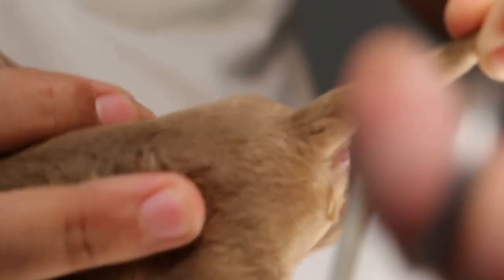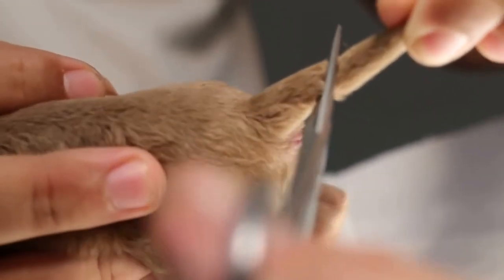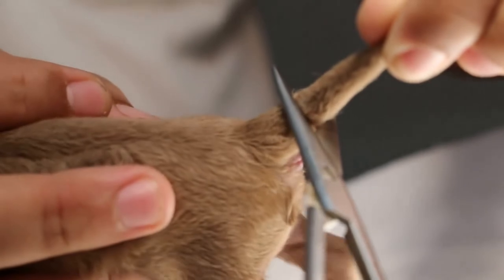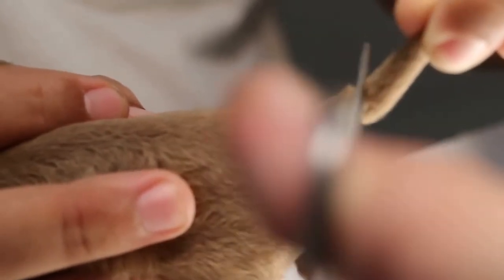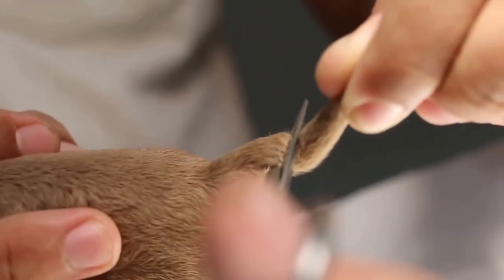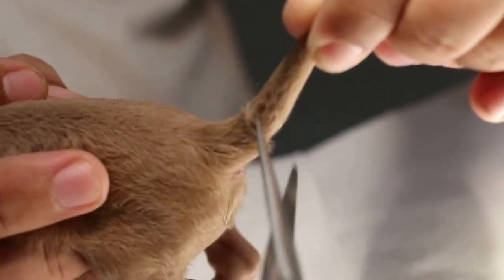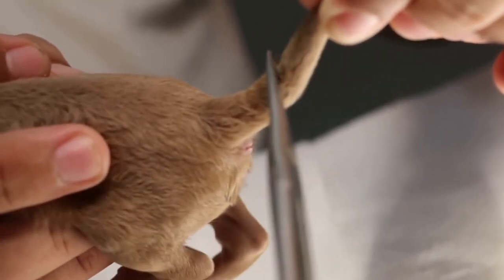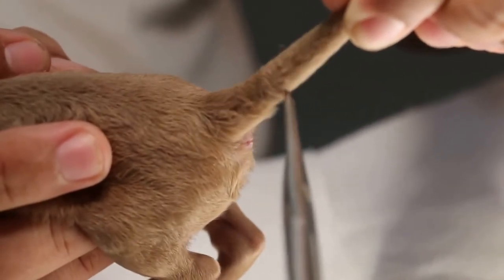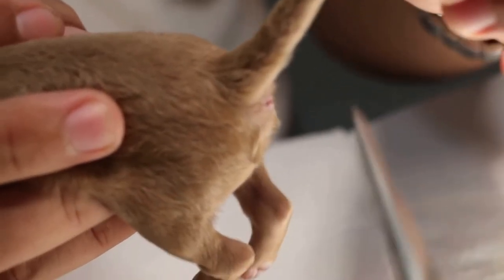The scissors are angled at 45 degrees. From the top, you turn the skin forward towards the anus so you have extra skin there. Then when you cut, the skin on top will go backwards and you have the extra skin to cover the bone.